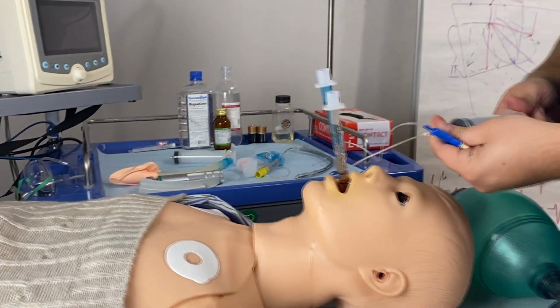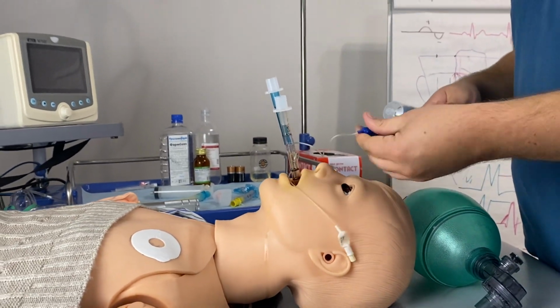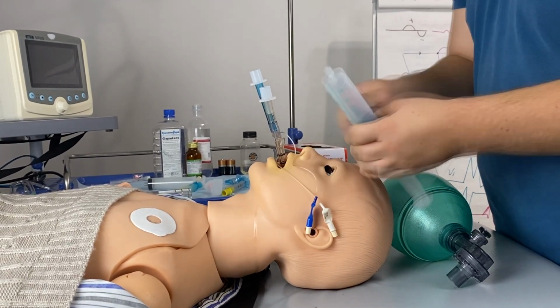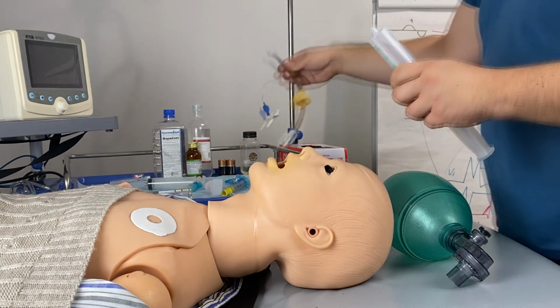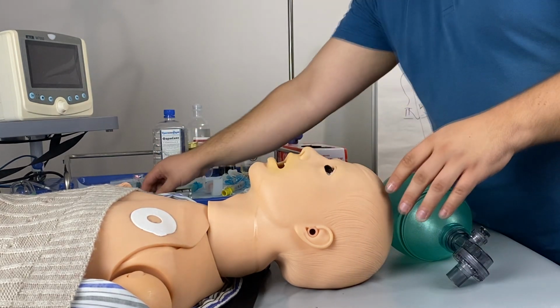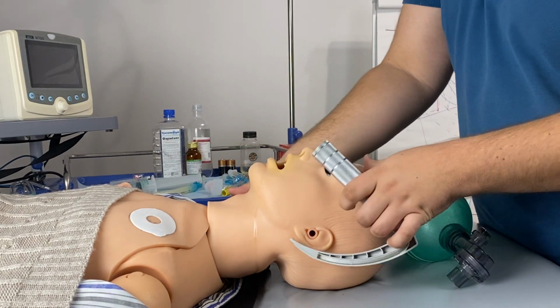Also don't forget about fixing the tube with bandages or with special fixation devices. And now we proceed to the intubation. So this is the hard one. We open the airway.